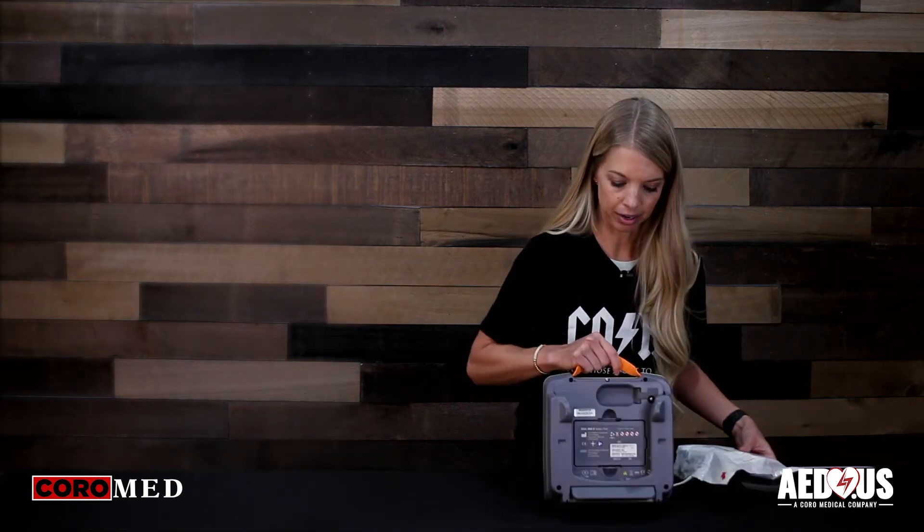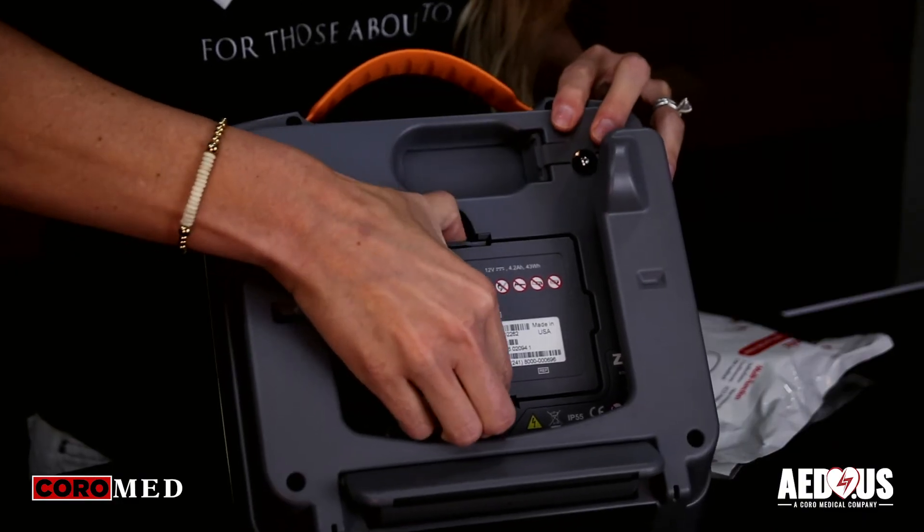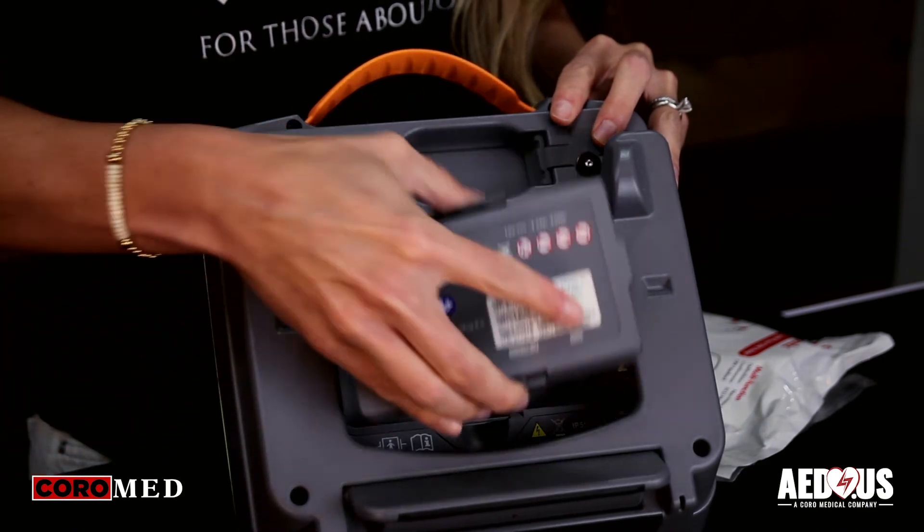Then you're going to turn it around and pull up on the clips here to remove. Take the new battery and insert it until you hear it click.